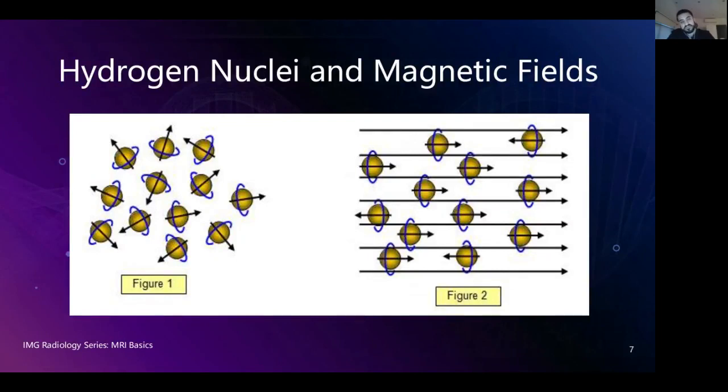So what happens to the energy of that hydrogen ion? Does anybody know what we would refer to as a low energy state or a high energy state? In terms of the first image, we would refer to that as a low energy state, okay? And the second image, we refer to that as a higher energy state.